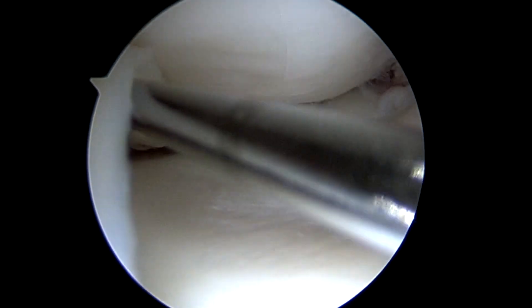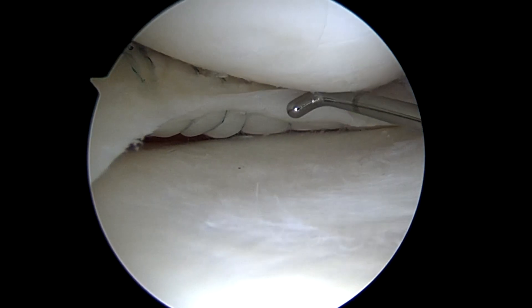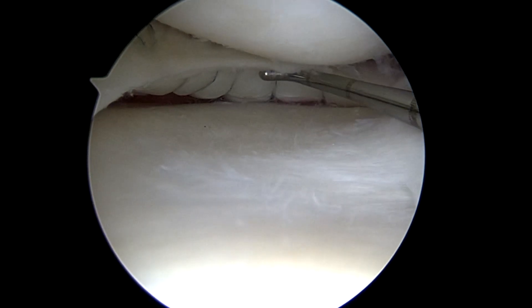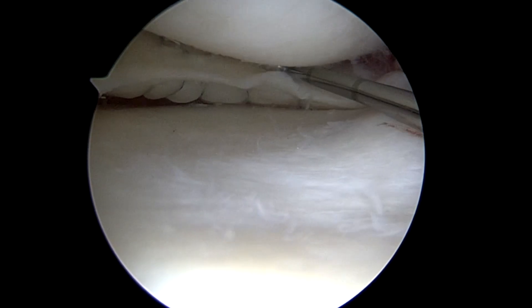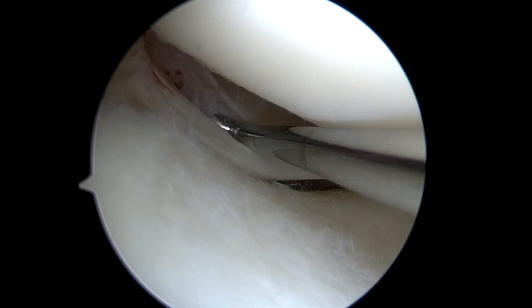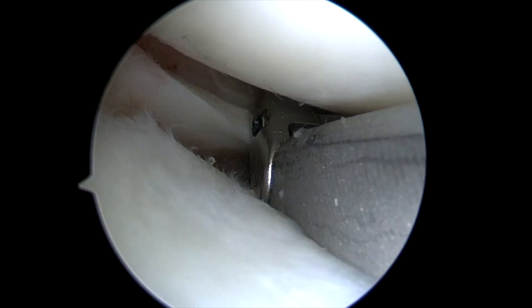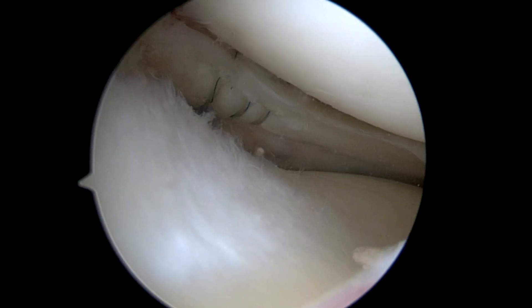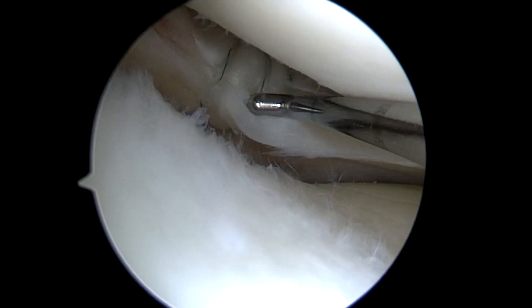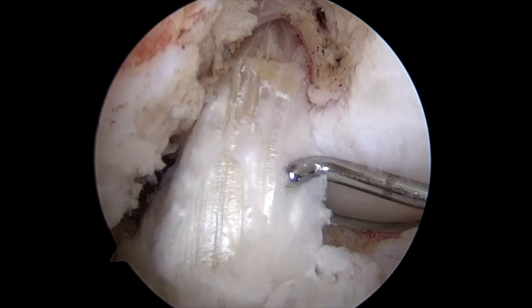Here's probing the medial meniscus that was bucketed — it's now sewn into the back of the knee with circumferential compression stitches so it can optimally heal on both the femoral and tibial sides. She also had a lateral meniscus vertical tear that was likely missed during her initial ACL tear, so this needed to be sewn as well with three circumferential compression stitches.